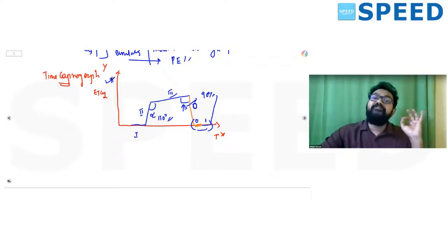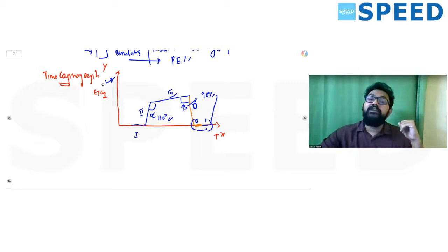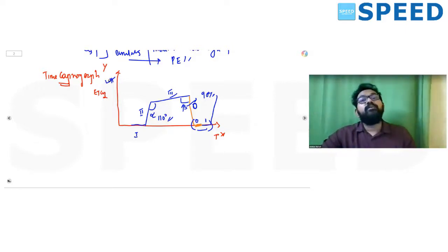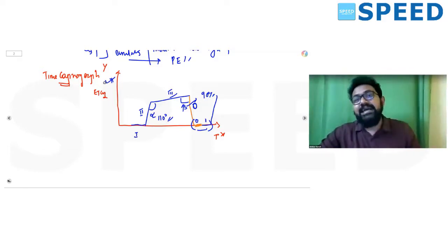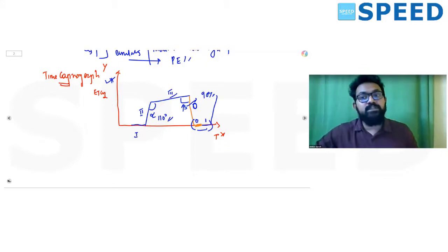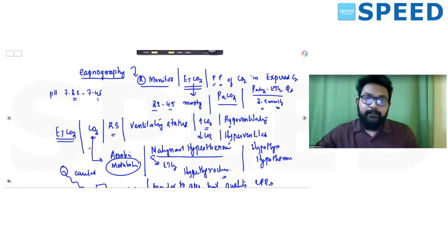So how do you identify endotracheal intubation? How do you identify esophageal intubation? How do you identify endobronchial intubation, etc., is going to be our topic for tomorrow. The question will be formed based on some kind of clinical application of capnograph for tomorrow, right? So I hope you enjoyed this basic idea of capnograph. This is the physiology of capnography. You have to be absolutely sure to understand the consequences and clinical significances of capnography.